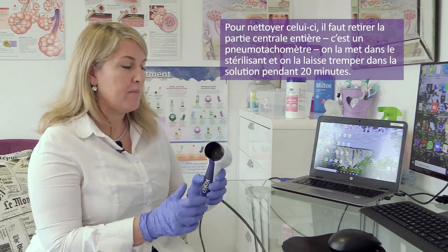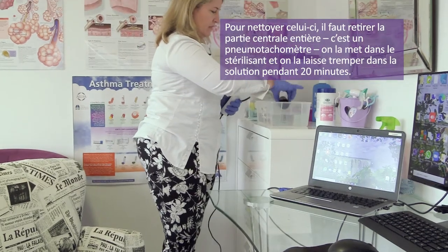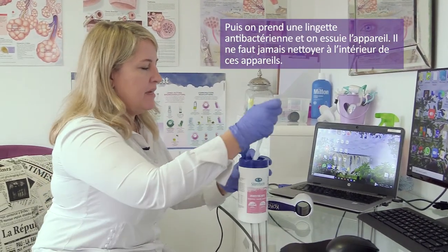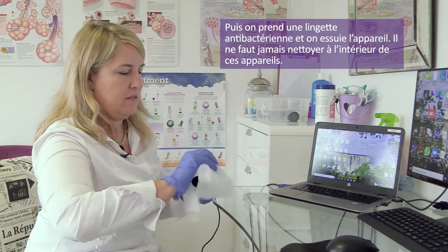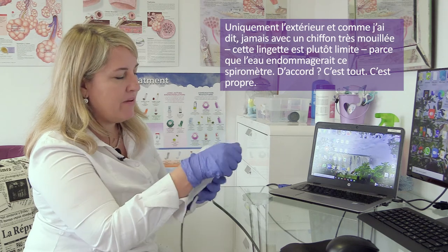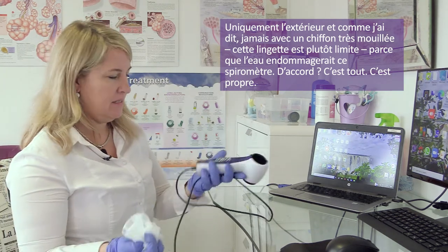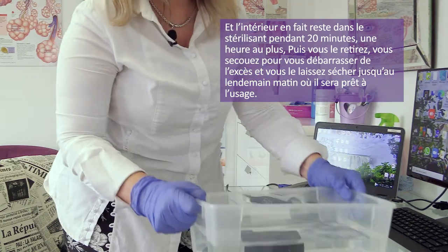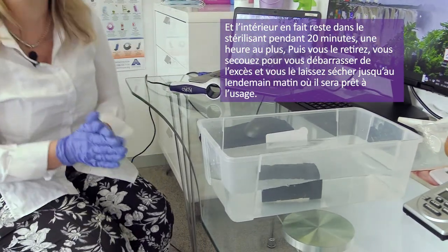To clean this spirometer, pull out the entire middle section — this is a pneumotachograph. Pop it into Milton and leave it there to soak for 20 minutes. Then take antibacterial wipes and clean the device — but never go inside these devices, only clean the outside, and never with very wet cloths because water will damage the spirometer. The inside sits in the sterilizing solution for about 20 minutes, maximum an hour. Then shake off the excess and leave it to dry ready for use the next morning.